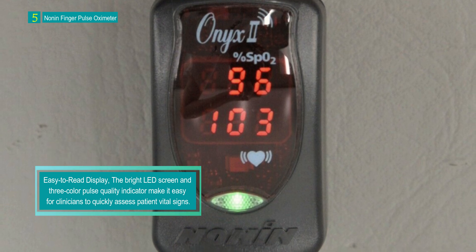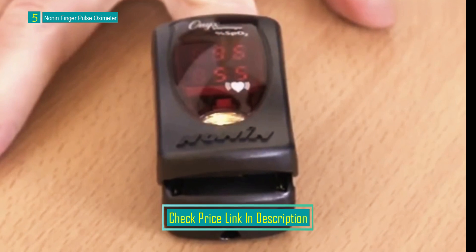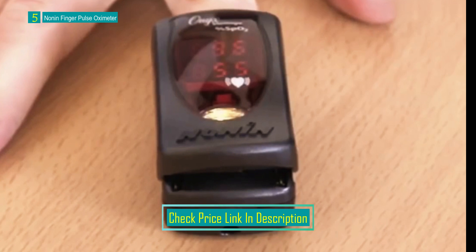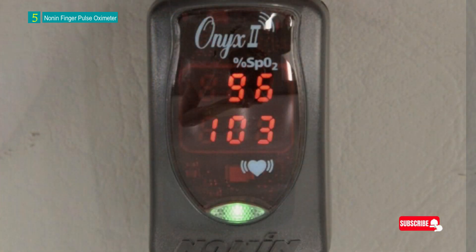The oximeter features a clinician-facing, easy-to-read bright LED screen that allows healthcare professionals to quickly assess a patient's vital signs. The device incorporates a three-color pulse quality indicator — green, yellow, or red — that aids in evaluating the quality of the pulse signal.